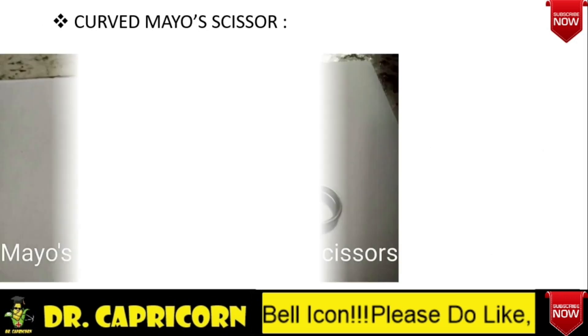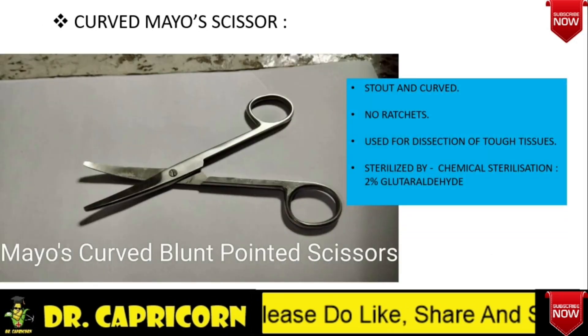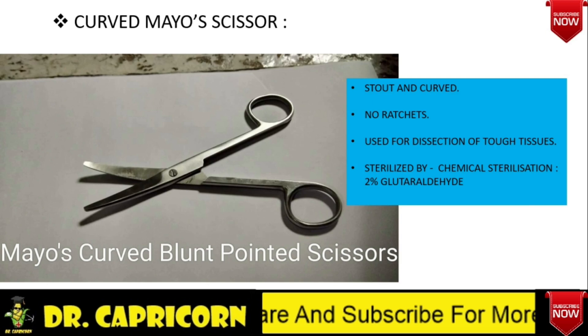Curved Mayo scissor — it is stout and curved, and there is no ratchet present in the scissor as well. It is used for dissection mainly in tough tissues, like fascia. For example, when we are going for debridement and amputation, we have to cut the tough structures, so we would use this curved Mayo scissor. This is also sterilized by chemical sterilization.